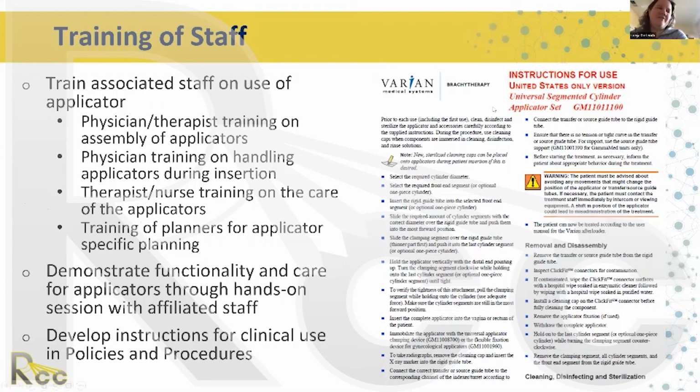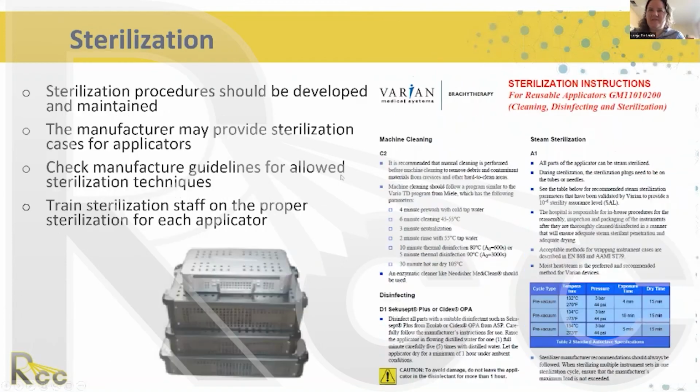Yeah, one thing I've learned the hard way is we had sometimes little pieces that the sterilization folks interpreted as single-use items when they were reusable and threw them away. So I have pictures of every sterilization tray, what that should look like, and a list of components in there. And I gave them to central processing so they know what is reusable and what is single use. So it saved me a lot of money over time. It was work, but yeah. Next slide, please. I think there's one more.